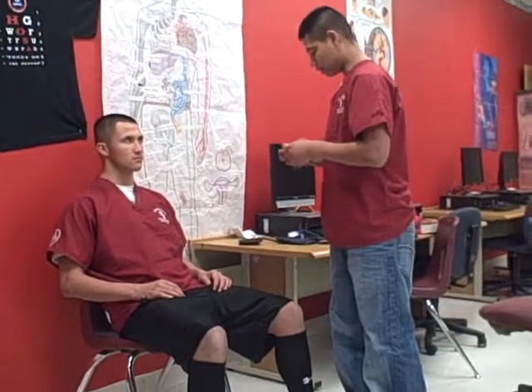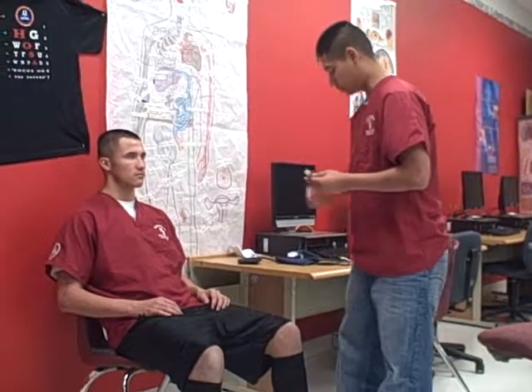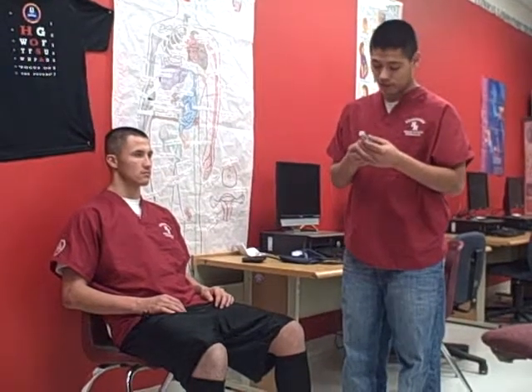I will be injecting this epinephrine into the lateral aspect of the thigh. I will recheck it — it is 0.3 milligrams of epinephrine — and recheck the expiration date.